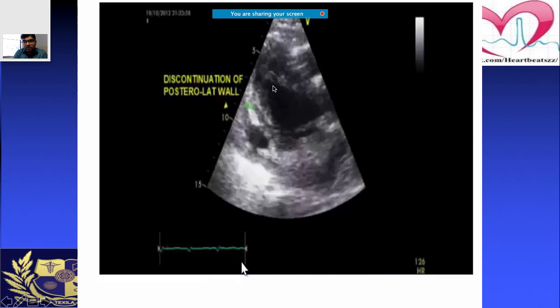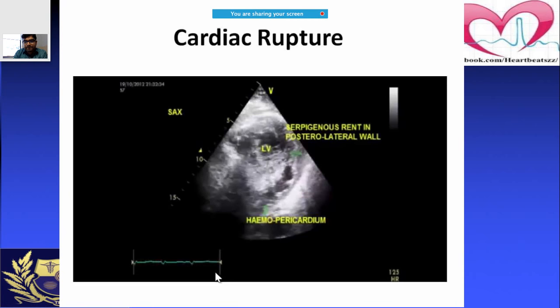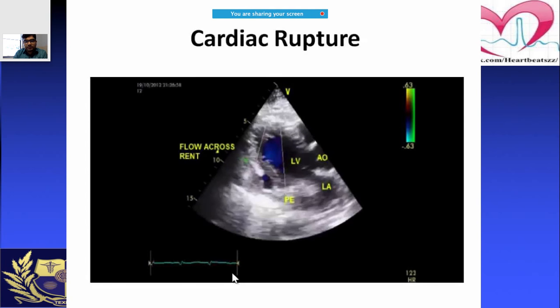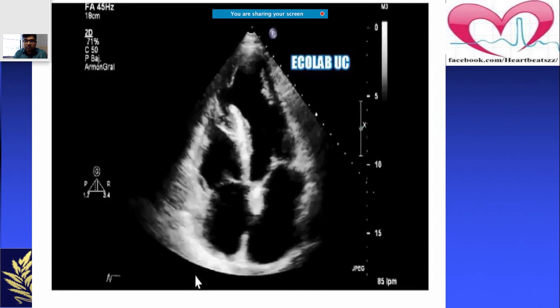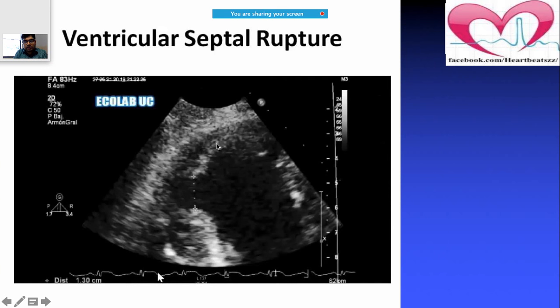In this chamber you can see discontinuation of the posterolateral wall. This was clinically confirmed as a hemopericardium. Multiple views provide a better idea of what is happening in which segment. You can also use Doppler for confirmation. A ventricular septal rupture after myocardial infarction is visible and can also be quantified.